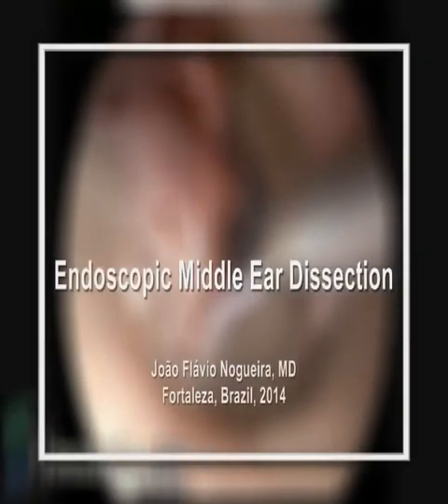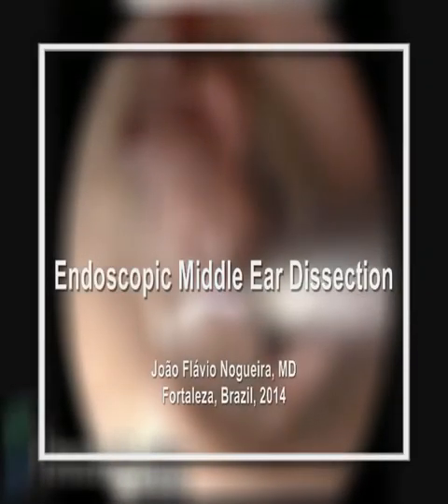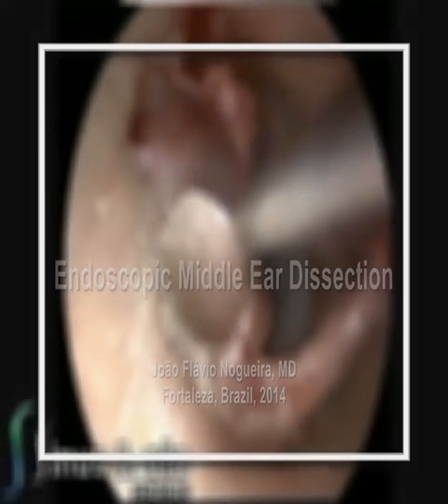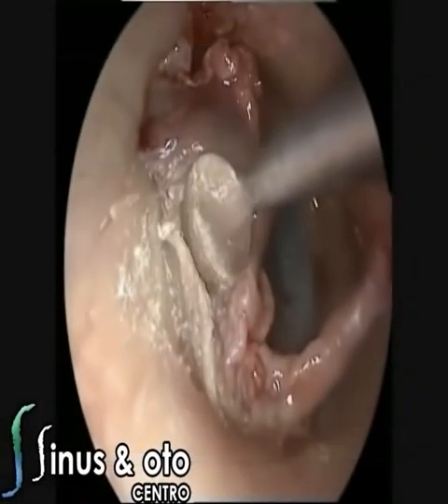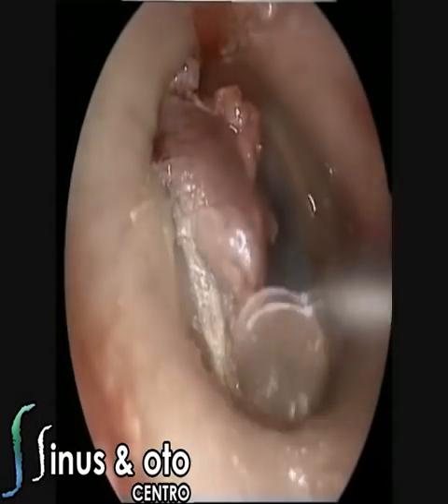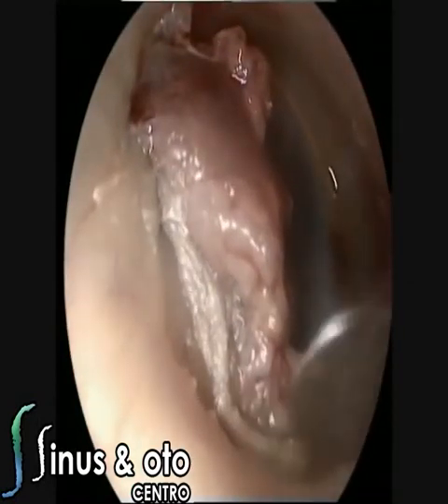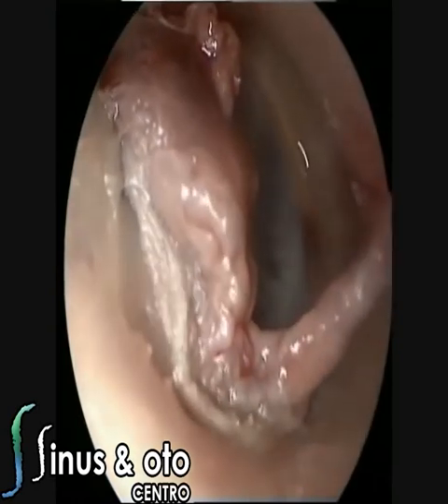Hello once again, this is Dr. João Flávio Nogueira from Brazil, and we are watching now a movie of an endoscopic middle ear dissection to show the middle ear cavity through this endoscopic approach.